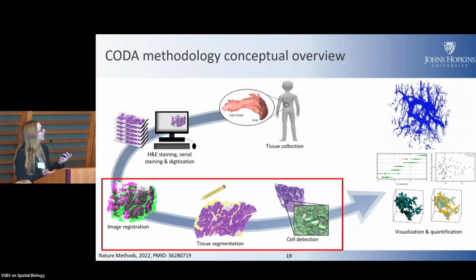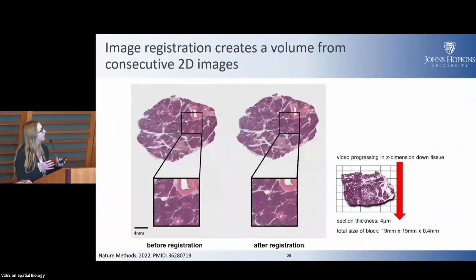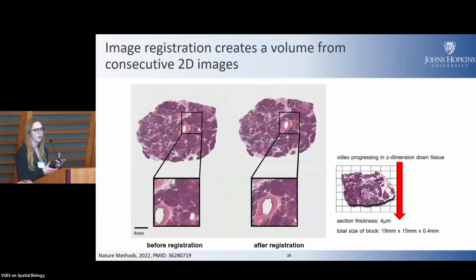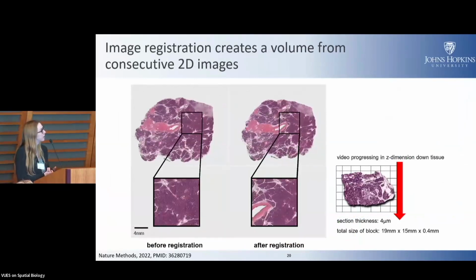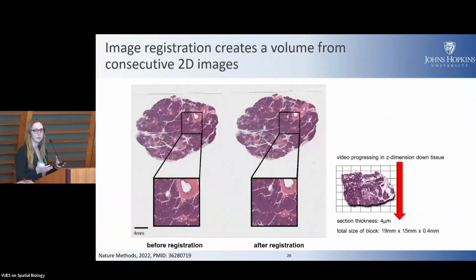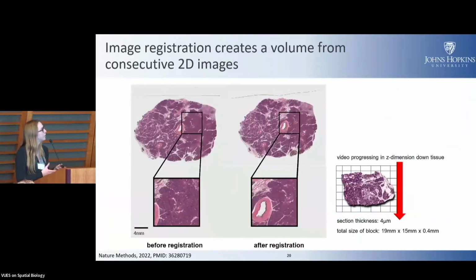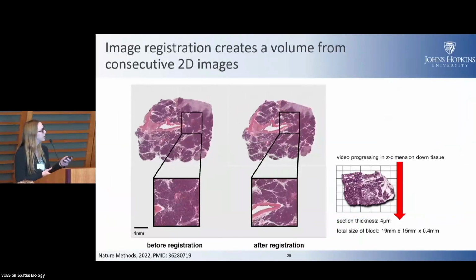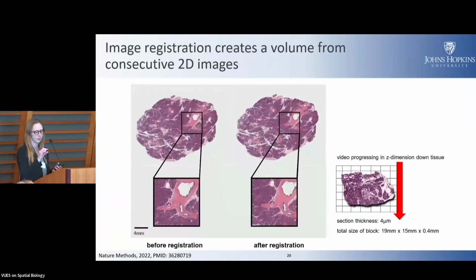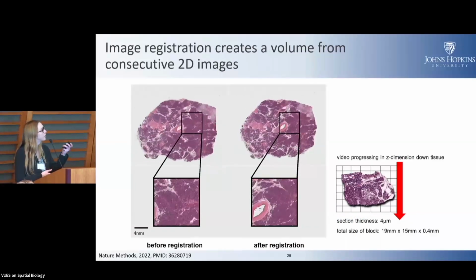So we begin with these data sets, and then we've been developing computational techniques that enable us to align this histological data. And again, unlike many techniques that use tens of images, we need to make methods that can align thousands of H&E images and not get that skewing and pulling that some techniques can have when you accumulate many images in a block. So this data set, I think, is about 2,000 slides. In physical size, it's about the size of Monopoly dice, is the analogy we like to use.